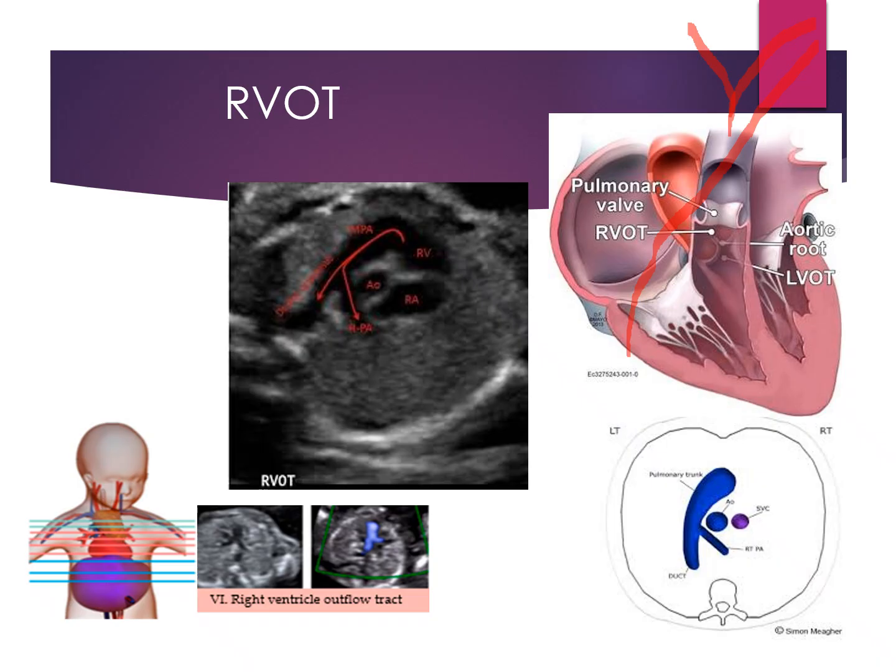So here I have our baby. Just take a look here. We were looking at these like this, but in reality, we're going to be cutting it like this to see everything, or maybe even cutting it this way to make sure that we're seeing what we need to see. They're not just straight across transverse cuts.